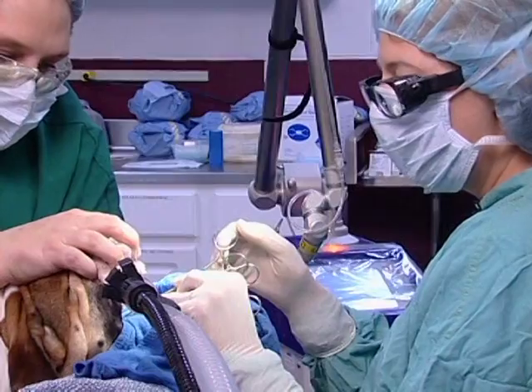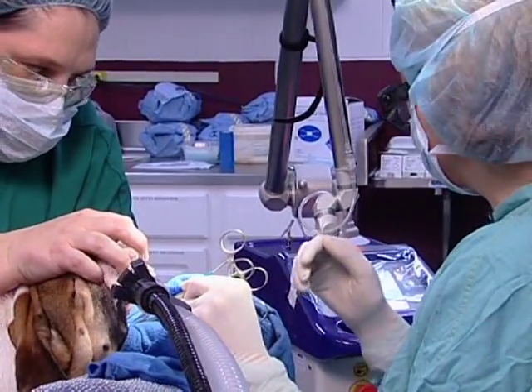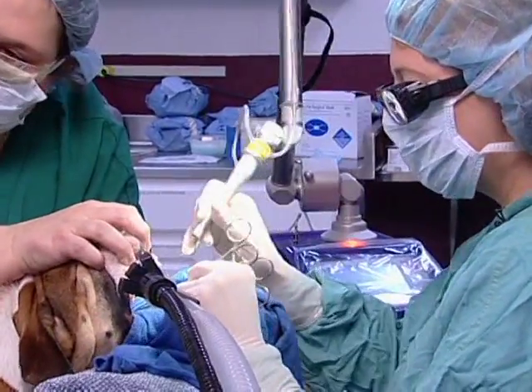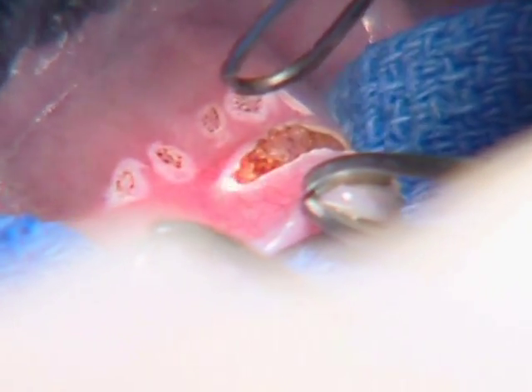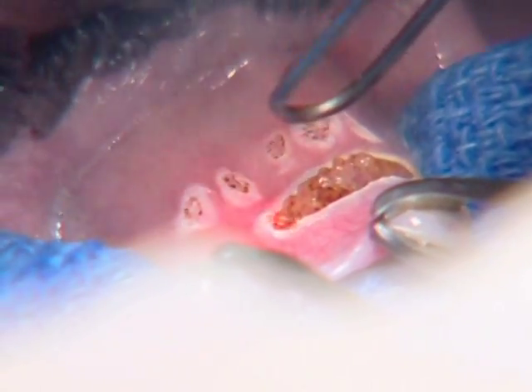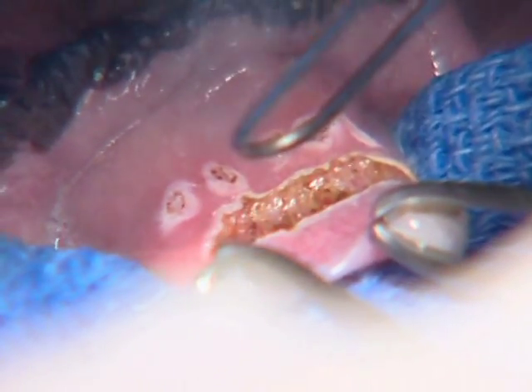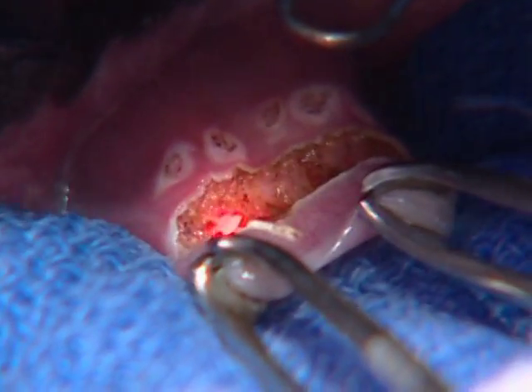I'm going to actually make my incision just caudal to those dots. Those dots will remain when I'm finished. Slow and steady is what you want to do — you don't want to have too much traction or you'll tear. There are blood vessels that run laterally, right and left lateral vessels, and you may hit them. But again, you will still see that your hemostasis is amazing compared to anything you may have tried with a scalpel.